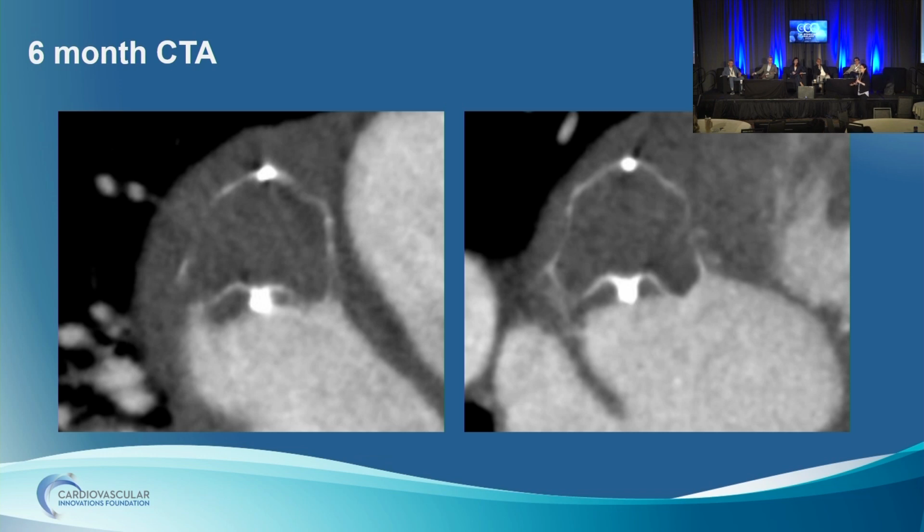I do think TEE could be reasonable because, again, the image on the right side still looks laminar on the surface, but whether or not we're getting more of a mass-like clot forming on the left side, that's the question at this point. But we will do follow-up imaging in 3 months again.